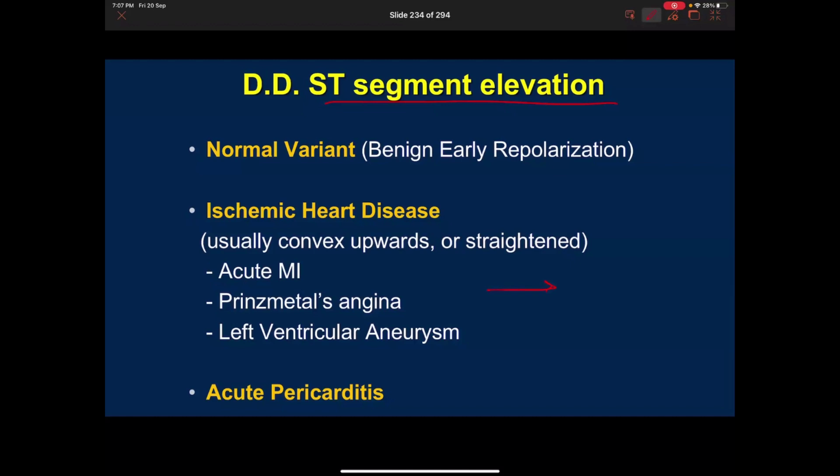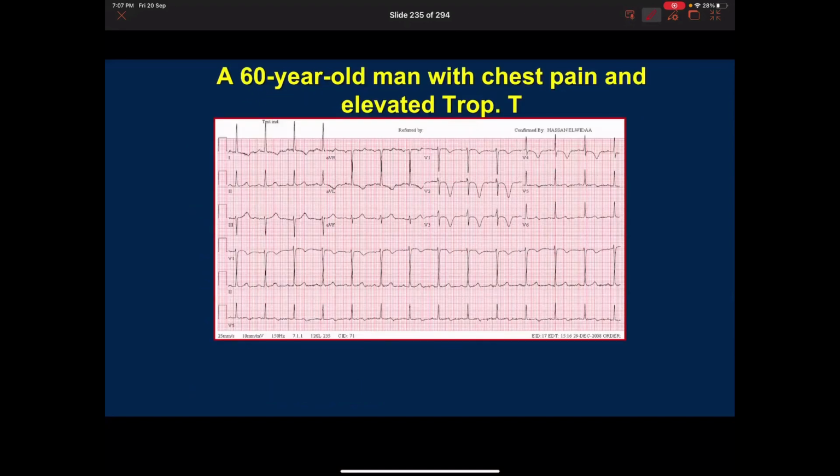Because an ECG is not just one heartbeat, it's many. So you see a STEMI, then it goes away. It's Prinzmetal angina, due to a spasm. Exactly. So this one can present with an ST elevation, but then it goes away. Why? Because this is a spasm of the coronary artery. The coronary artery will spasm and close, but then it's a spasm, so it will open back again. So we can confuse this with ischemia when it's not. Okay, what about this one?